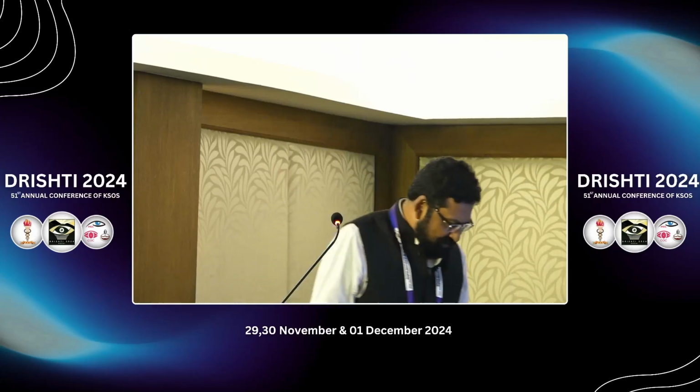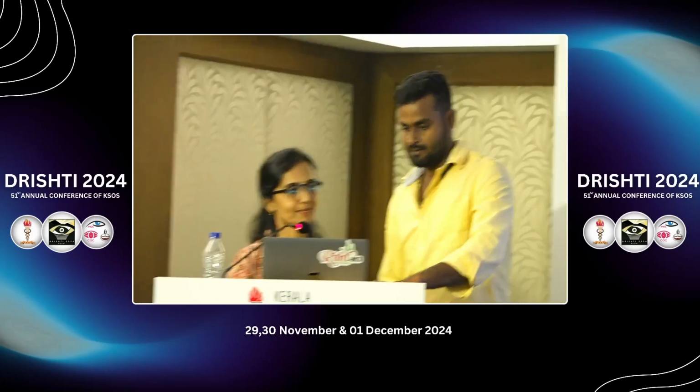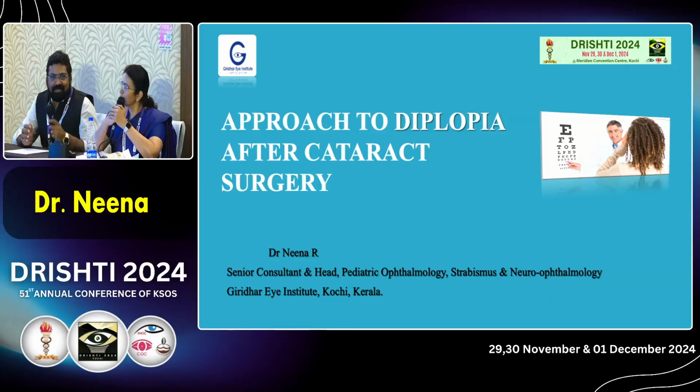Thank you. And another thing is, if the patient is happy with the spectacle correction, you don't have to go for IOL exchange also. We should talk to the patient and then come to a conclusion. So if the patient is happy with spectacle correction, I think that is the first option, because IOL exchange is associated with some complications also and depends on the surgeon's experience also. That's what I was commenting.